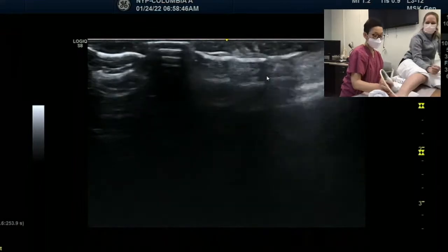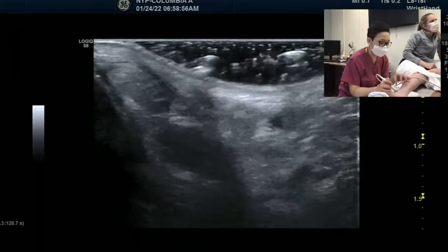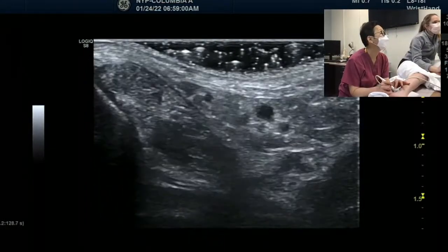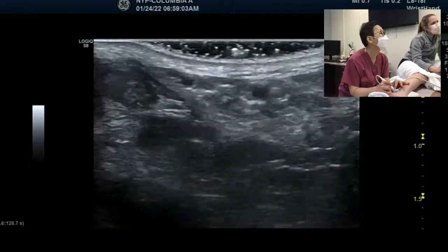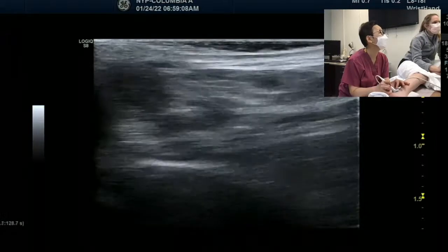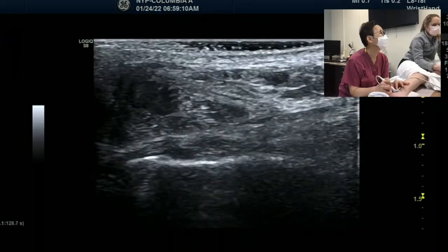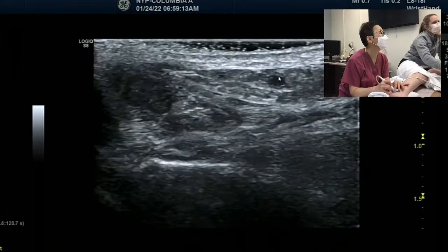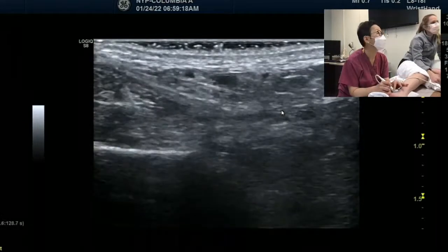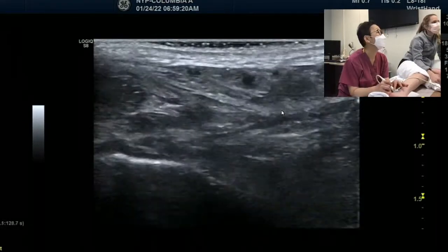So let's move to the hockey stick probe. I wanted to show you the whole environment, and now we are paying attention. So much better here. You can see the small saphenous vein, and next to it is the sural nerve. So we're going to chase the sural nerve up proximally.